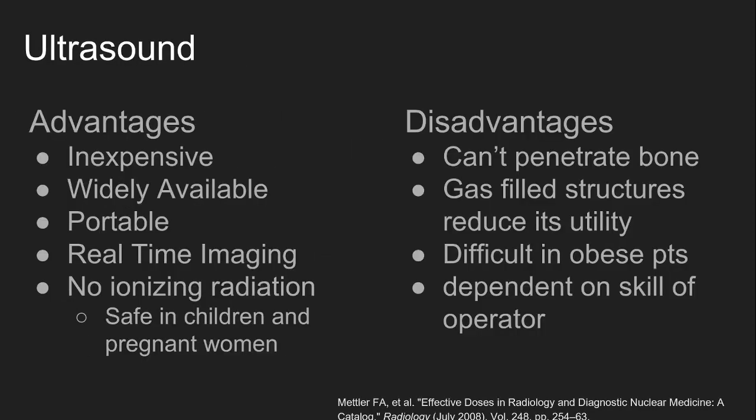Some advantages to ultrasound are that it is relatively inexpensive and widely available. The machines are portable and provide real-time imaging ability. Additionally, there is no radiation exposure, so they are the preferred modality in children and pregnant women.